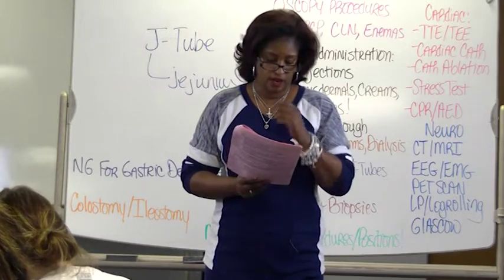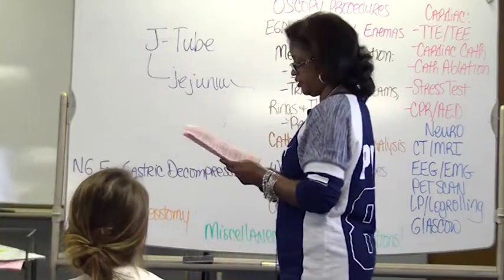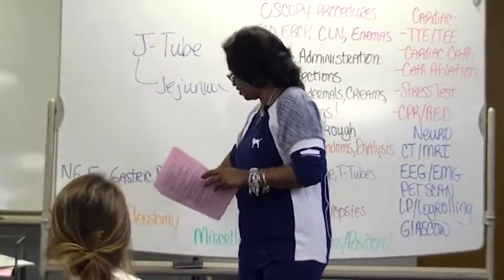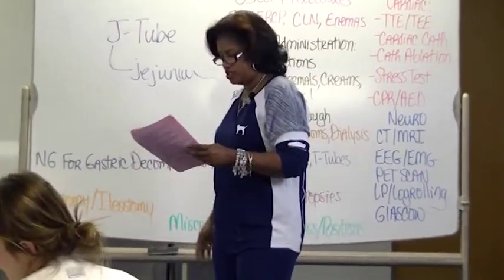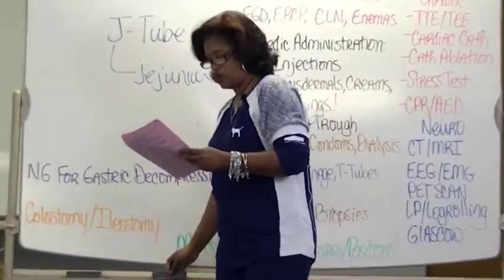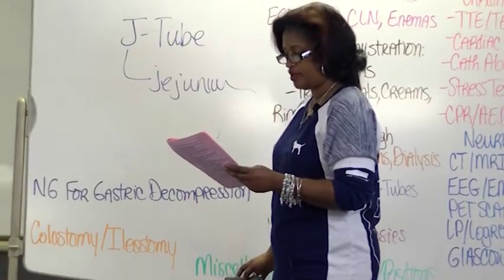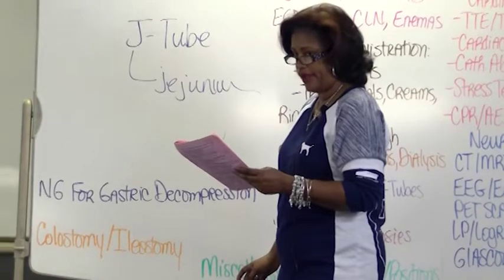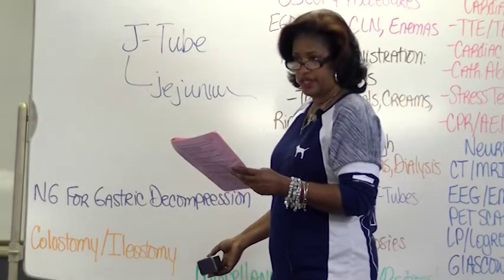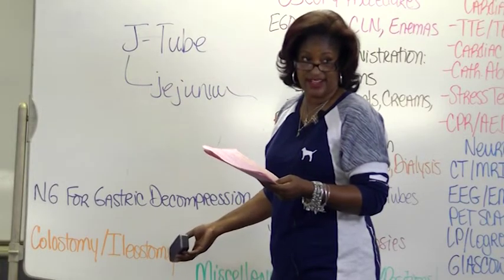Okay. All right. Now, so that's that. Next on the lineup, this. One last thing. Look what I wrote for the pH. What is the pH if I put it in the small intestines? So I don't do a gastric decompression, but I do a Miller-Abbott. If I do a Miller-Abbott, what is the pH? Look what I wrote. You see how the pH of the small intestine is really, really high? It's alkaline, right? What's the stomach?